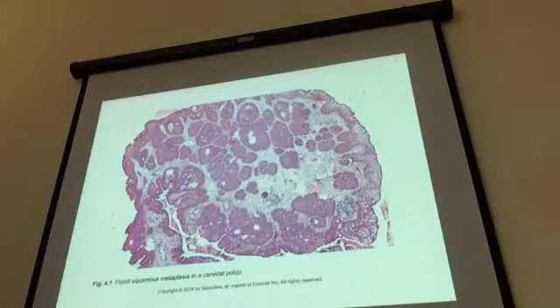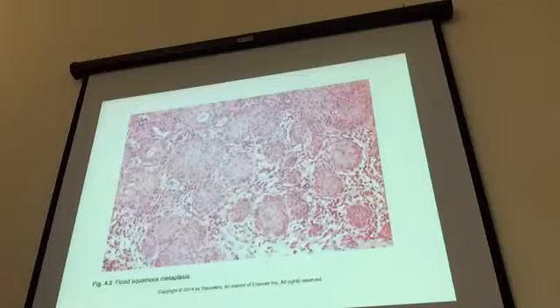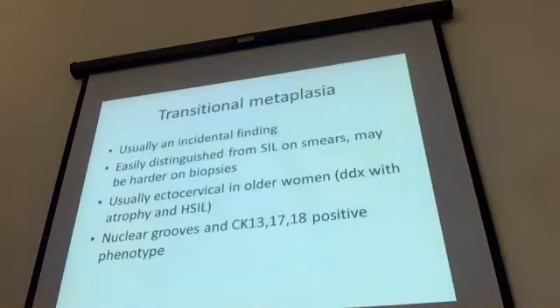Mature. And this word florid, florid means extensive, very growing. Florid means like a flower. It's growing. Typically, with this process, you'll see some remnant of a lumen or some remnant of columnar epithelium on some surface, but you may have totally solid nests, and you will probably have inflammation associated with it as well. Not a hard diagnosis, but very common.